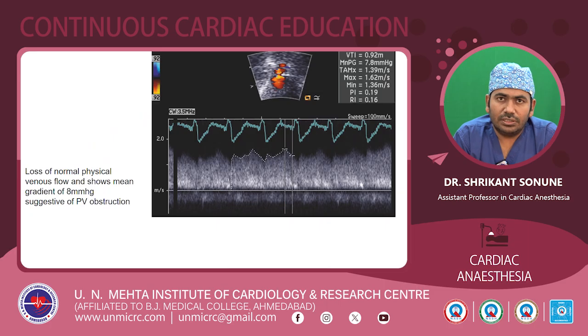This is an echo image of the spectral Doppler tracing of the pulmonary vein, which does not show any specific venous waveform pattern. On tracing the waveform, a mean gradient of around 7.8 or 8 millimeters of mercury can be measured, and there is flow turbulence on the color flow mapping, which is suggestive of pulmonary vein obstruction.